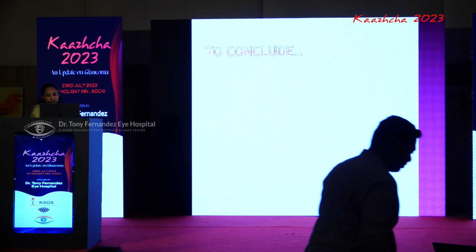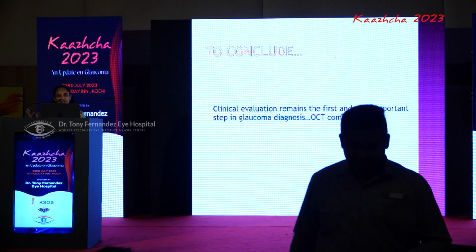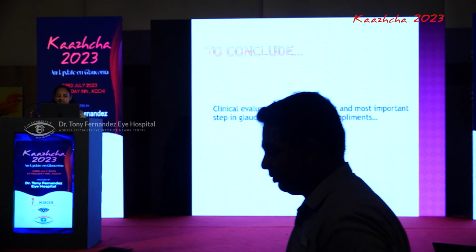So to conclude, clinical evaluation is the first and the most important step in the diagnosis of glaucoma. OCT can complement in the management of glaucoma. Your clinical evaluation, the intraocular pressure and the perimetry are the most important tools as compared to OCT. OCT has to always be judged with caution. Thank you.